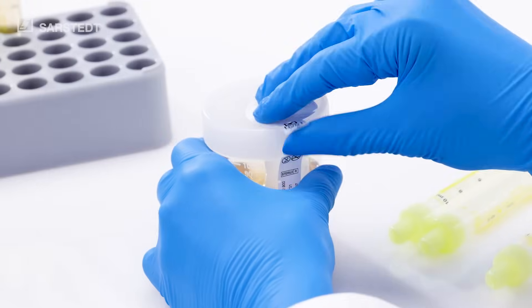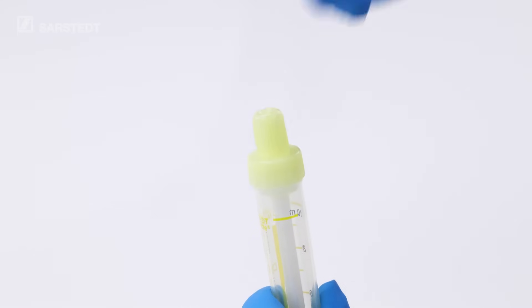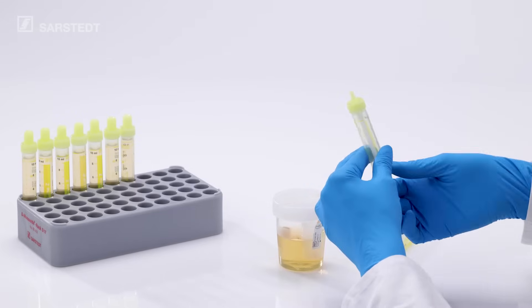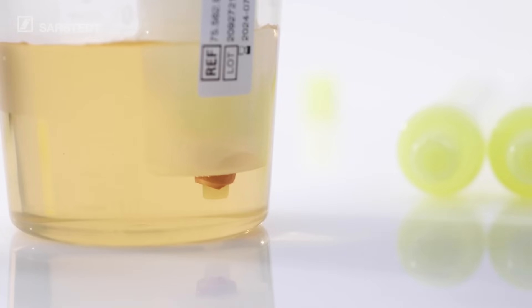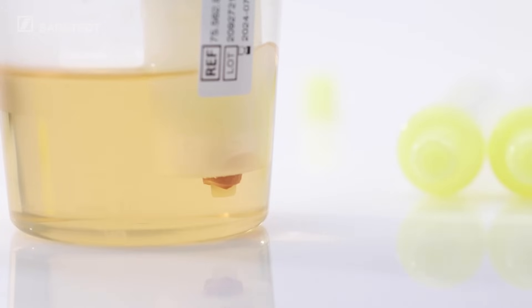Remove the safety label above the transfer unit and remove the stopper from the Urine MonoVet. Insert the Urine MonoVet into the transfer unit. With slight pressure, the Urine MonoVet penetrates the NFT membrane where it is now securely seated for the collection process. By pulling on the plunger, the urine flows gently into the Urine MonoVet.